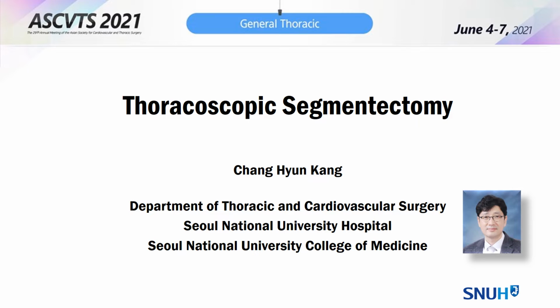Today's presentation is about thoracoscopic segmentectomy. I will mainly focus on the technical advancement and the recent issues on thoracoscopic segmentectomy.